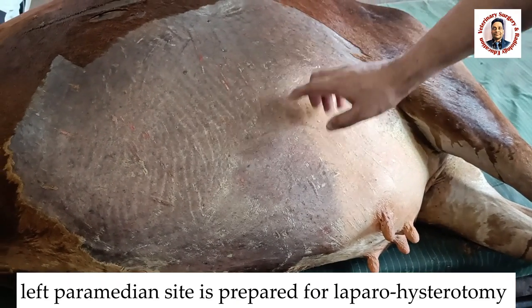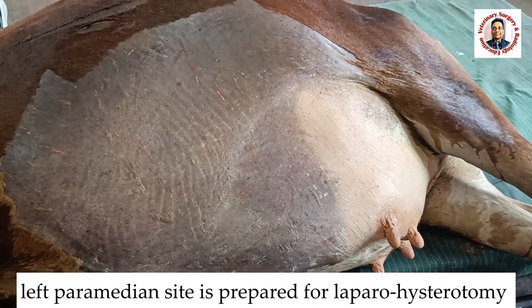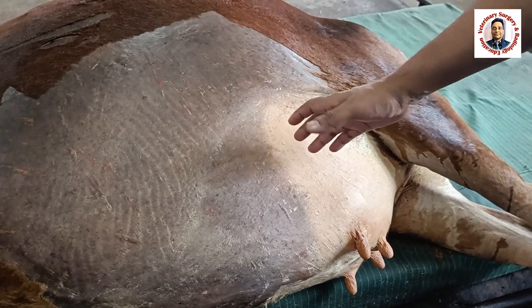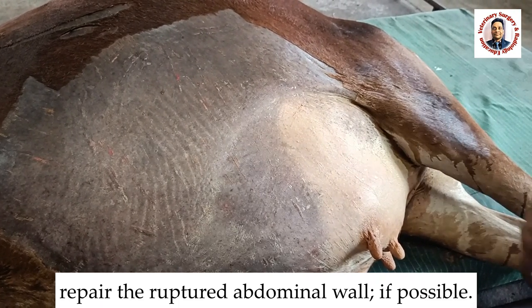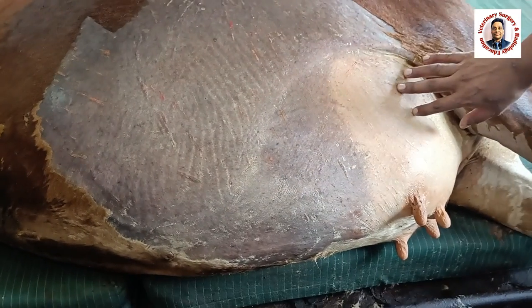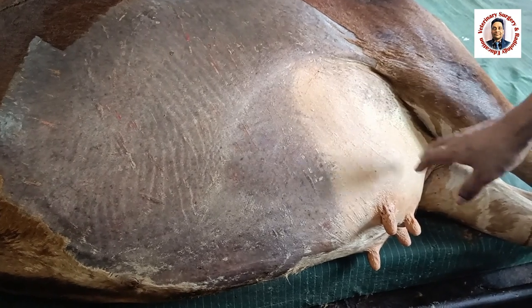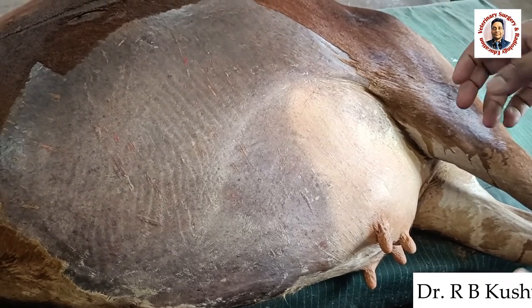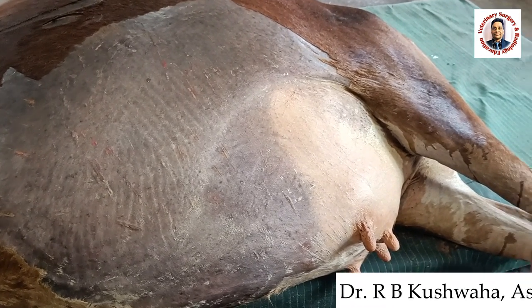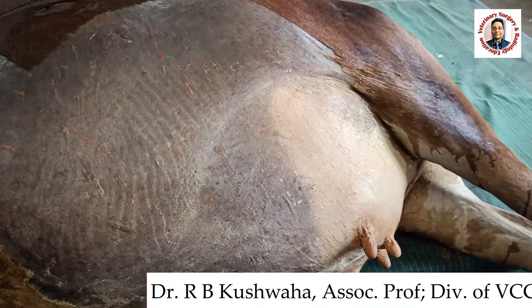We will prepare the left side of the paramedian area. We will give an incision from here to here and then remove the fetus. After that, we will need to repair the rent, meaning the ruptured abdominal wall. Because of the presence of the fetus occupying the ventral area, it is very difficult to identify the actual herniation or rent in the ventral or lateral abdominal wall. Only after performing this procedure will we be able to know the actual picture of the defect in the abdominal wall.